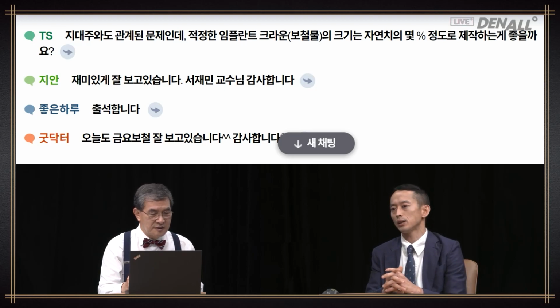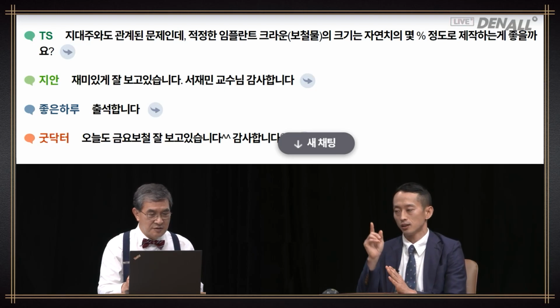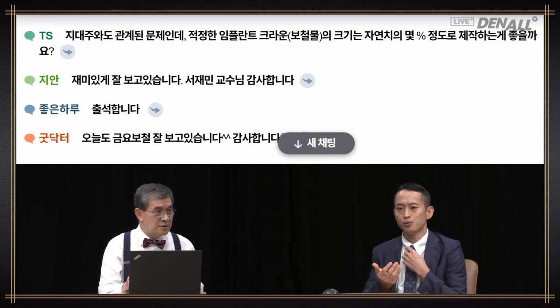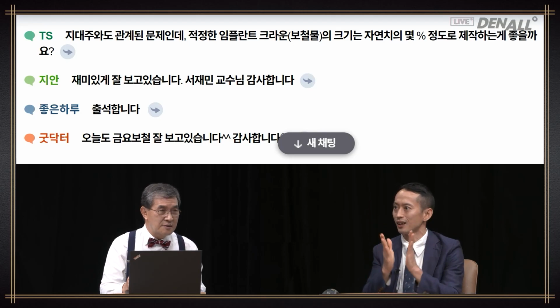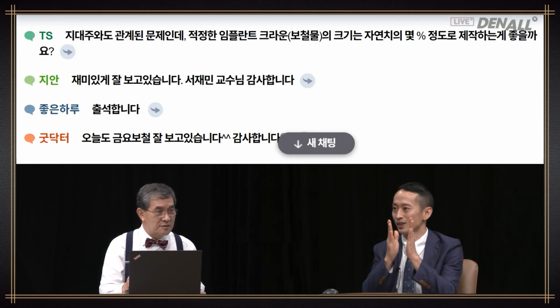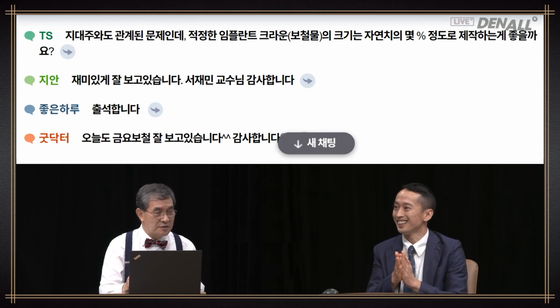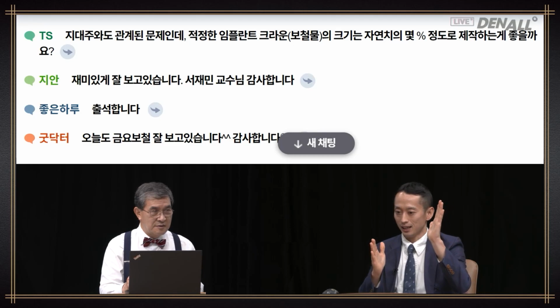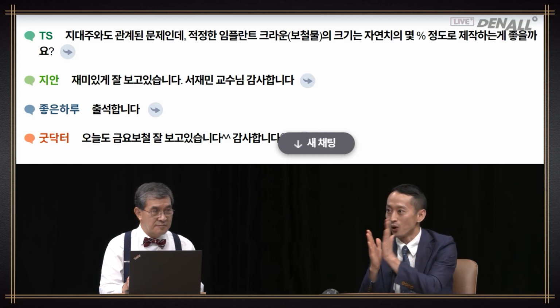In that case, however, in atrophied ridge, we cannot forget about intercuspal relation because satisfaction regarding mastication goes down significantly. In the past, when we emphasized implant-protected occlusion, people said that there should only be contact in the central occlusal surface. However, these days, we don't do that anymore. Contact is made better if you focus on the intercuspal position based on my experience.